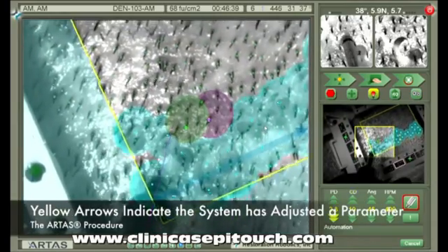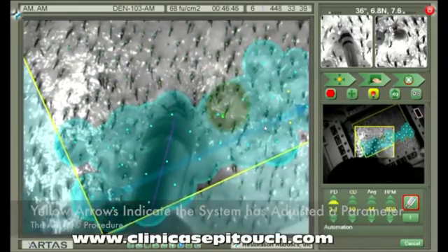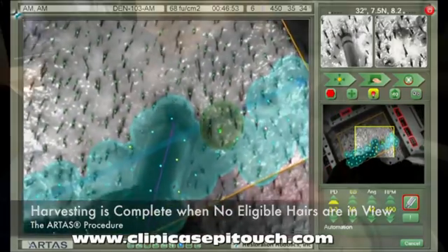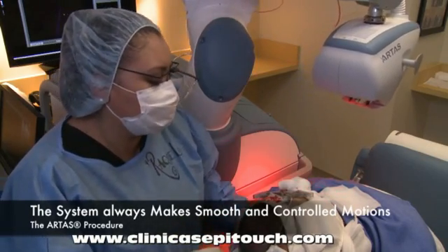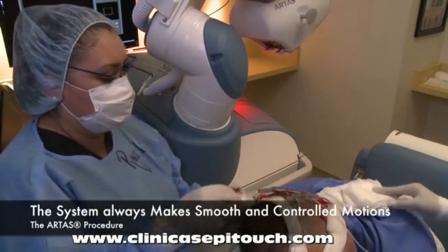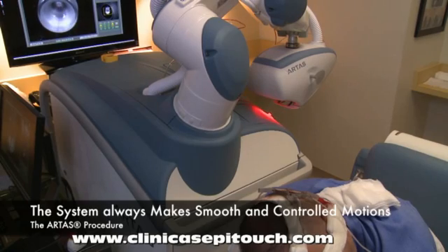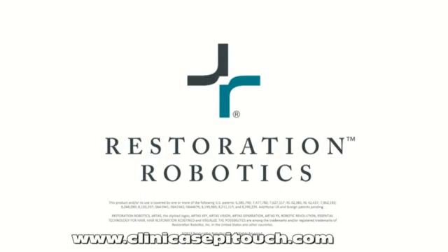Yellow arrows below each of the four automation parameters in the lower right-hand corner indicate that the system has adjusted a parameter automatically. Harvesting is complete when no eligible hairs are in view. The system always makes smooth and controlled motions. Immediately following the completion of a skin tensioner region, work begins on moving the skin tensioner to the next location. While this is happening, the system will automatically flush the suction system with saline. And that concludes this ARTAS procedure case example.